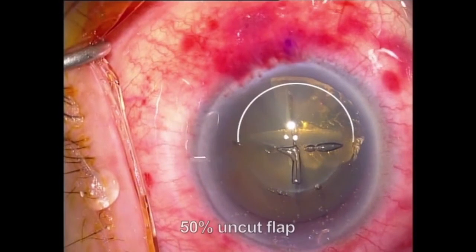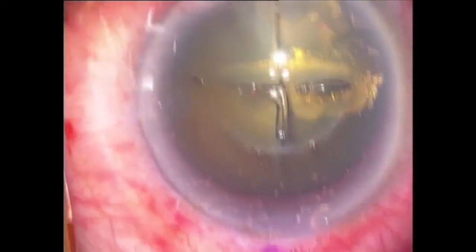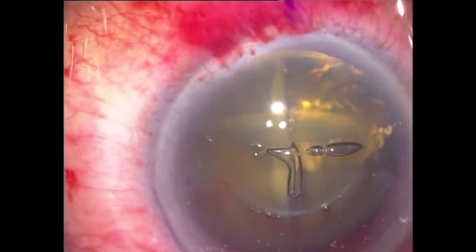Here we see one with a half uncut capsule. These two cases were from earlier generation femto lasers, and today the quality of smooth, complete femto CCCs is in excess of 95%.